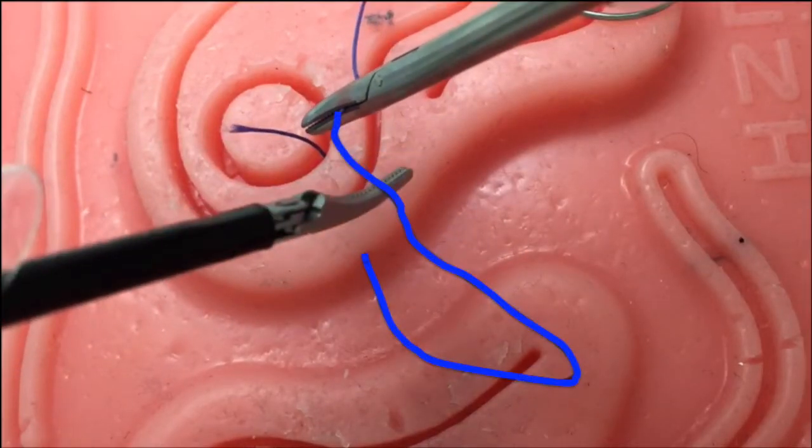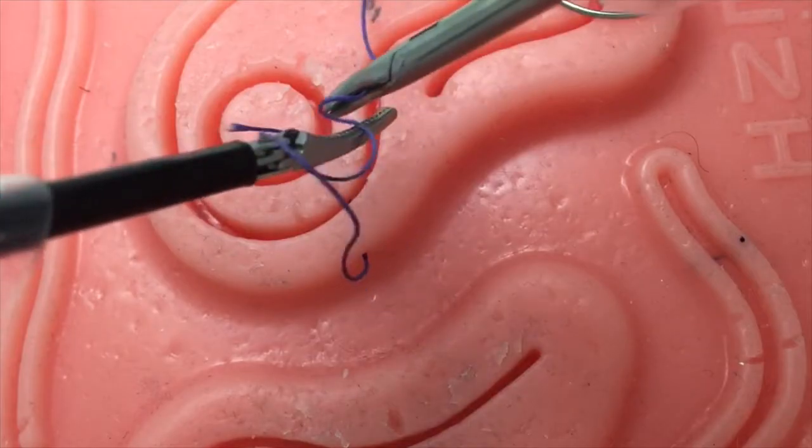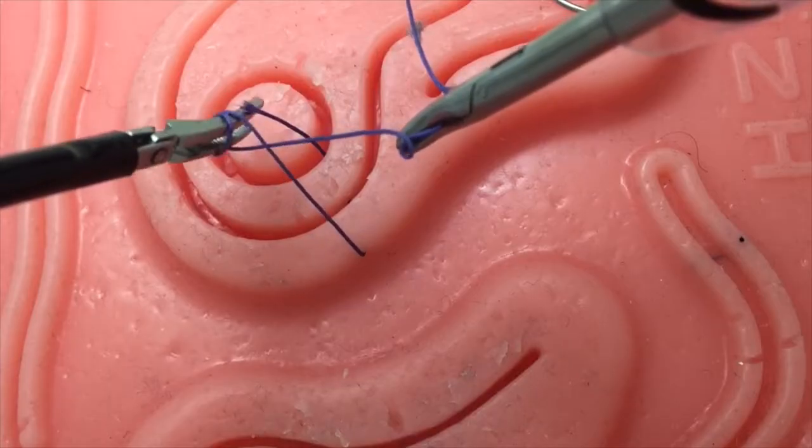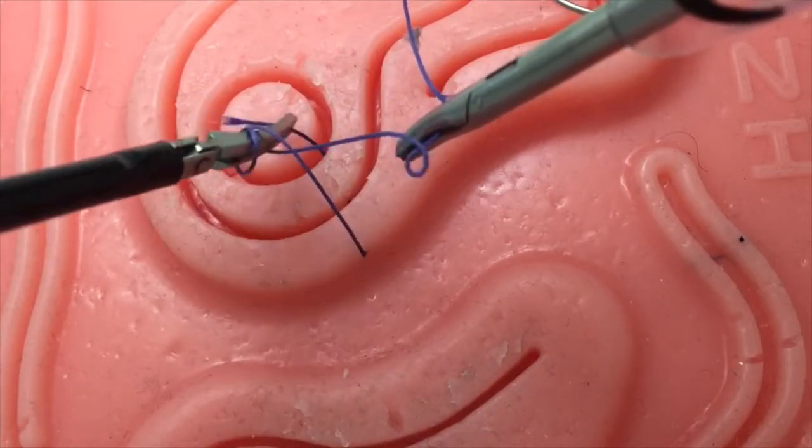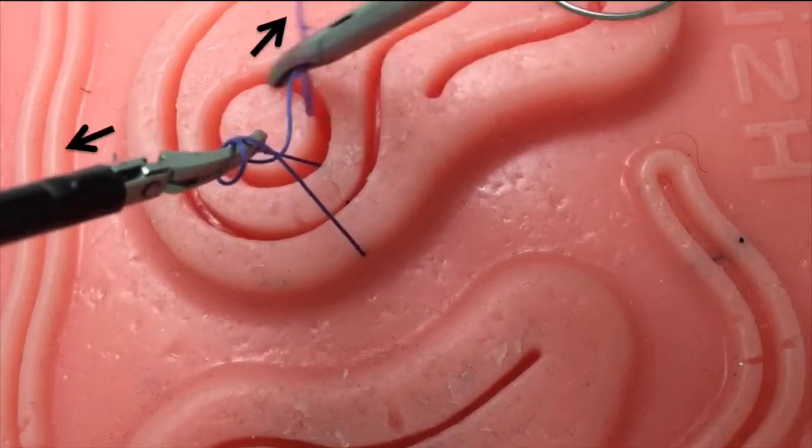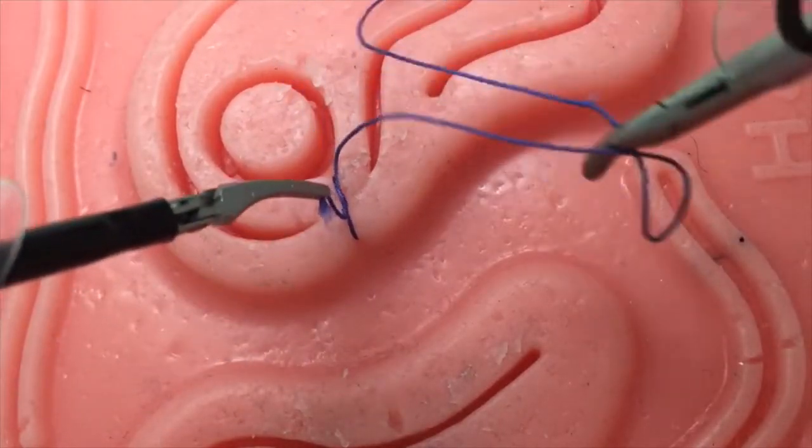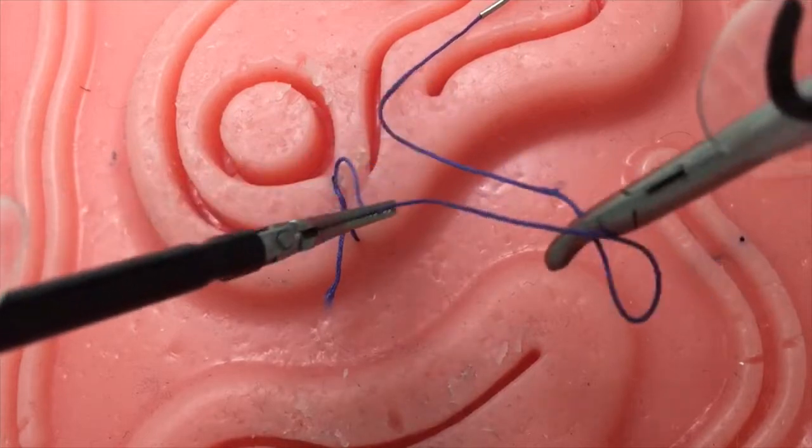Once the acute angle is created, place your left instrument inside the U and simply twist the suture twice around your instrument to create a surgeon's knot. Then, grasp the loose end with your left instrument while pulling upward while your right instrument pulls downward. Once the knot has been secured, create a second elongated U.